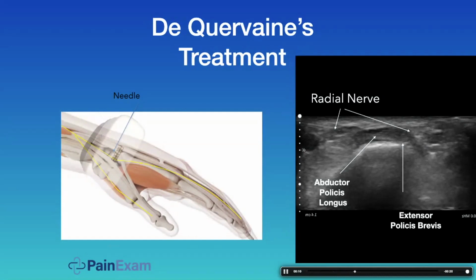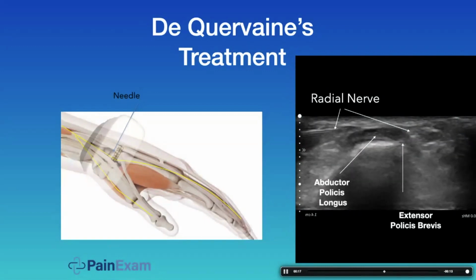So I'm trying to get past the nerve here. I'm hydrodissecting. And I went into the plane above the nerve to get to the tendons.